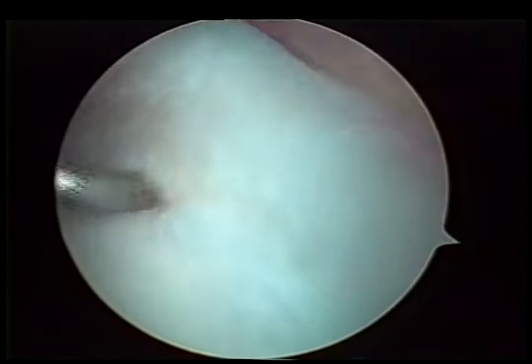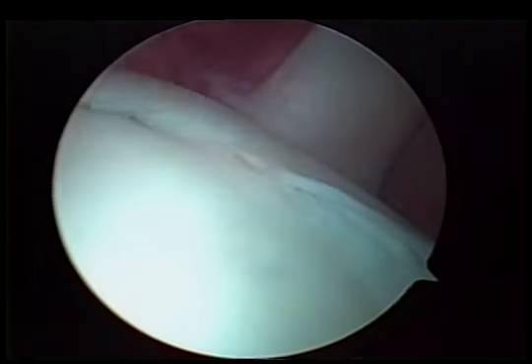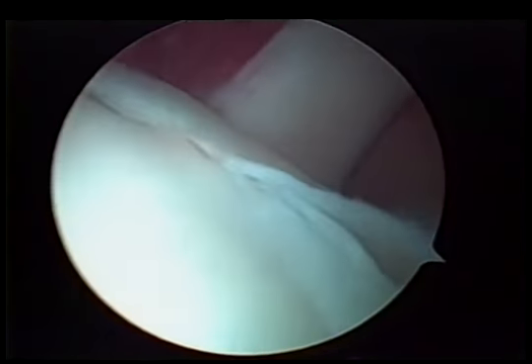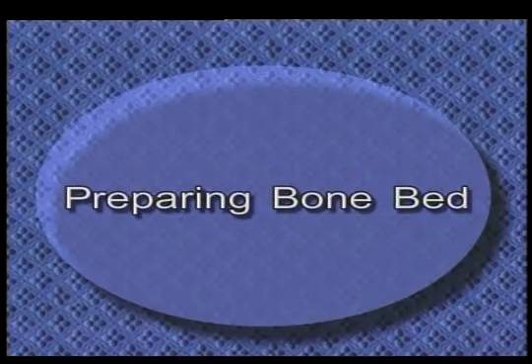This is a left shoulder. We're probing the superior labrum. The head is toward the top. Back here you see there is some detachment in the posterior superior quadrant. We'll check the peel back test, where the arm is brought into abduction and external rotation, as we watch. You see the whole biceps labral complex peeling back over the edge of the glenoid when it comes into abduction and external rotation, including the root of the biceps.